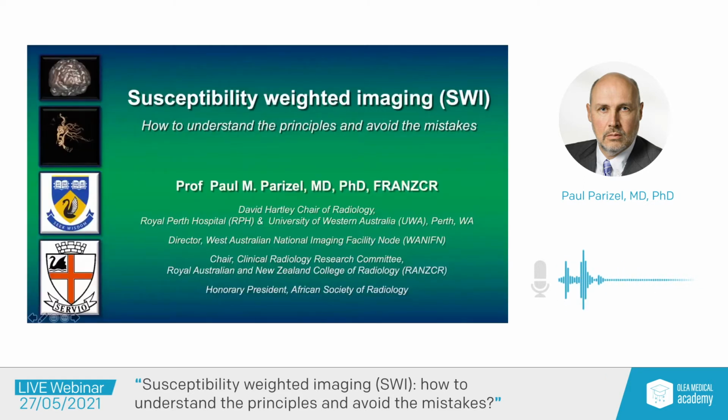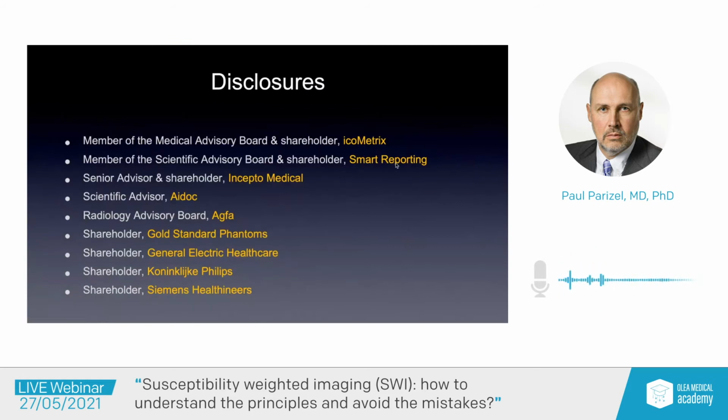Now, our topic today is going to be susceptibility weighted imaging, and I chose a subtitle, How to Understand the Principles and Avoid the Mistakes. And that's what we are going to try to do in the next 25 to 30 minutes. I do have some disclosures that you can see listed here on this slide, but I don't think that there's actually anything that will have a conflict of interest in my presentation.